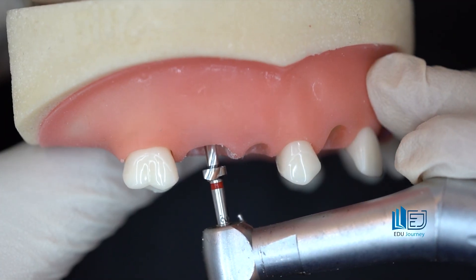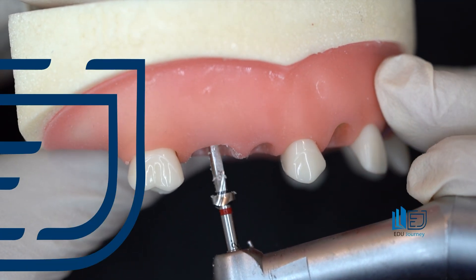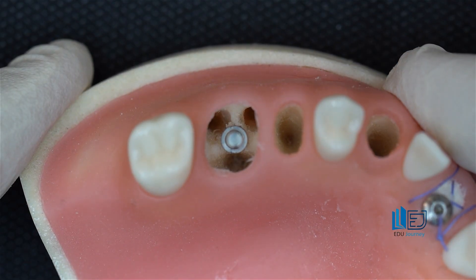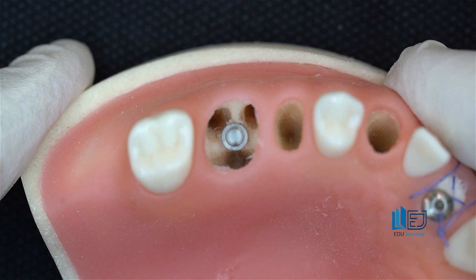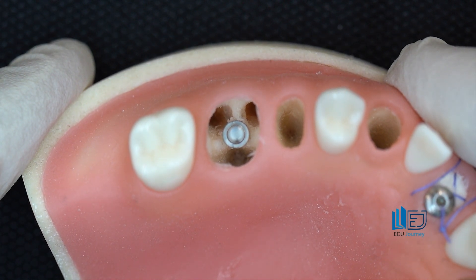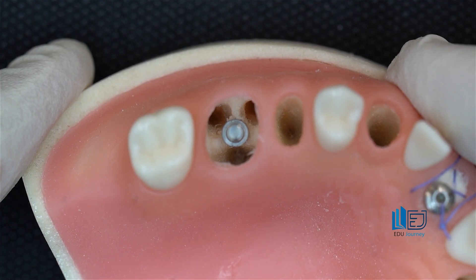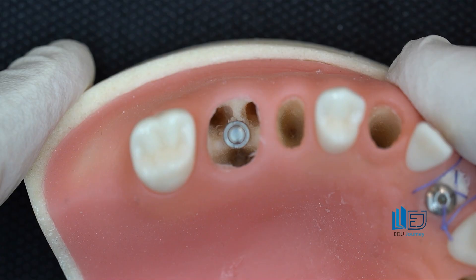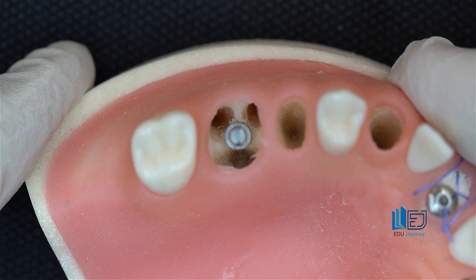After the first one or two drills, place the parallel pin again and evaluate buccolingual and mesiodistal positioning. Pay attention — my drilling is exactly in the furcation area. I didn't let it enter any of the sockets: not the palatal socket, not the mesiobuccal, or distobuccal. Rather, drilling is exactly in the furcation area so our implant can be placed there.